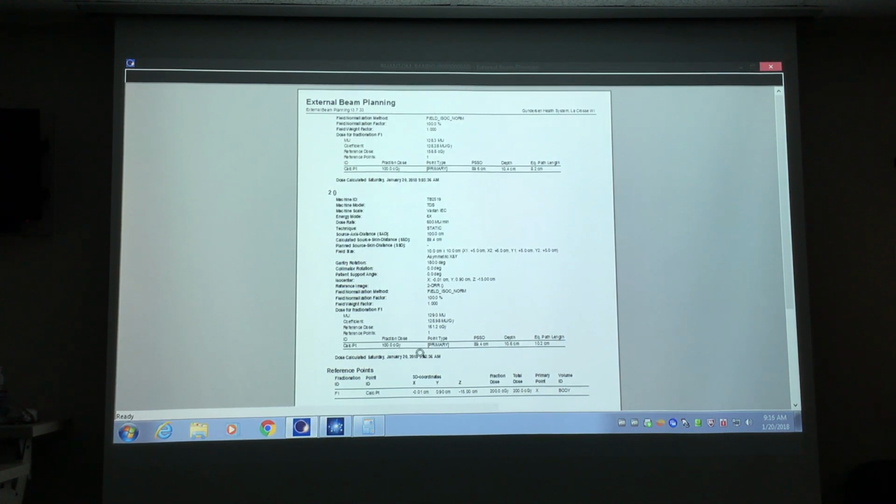So I would encourage you to go through your data book and calculate the monitor units for these. And basically what you're going to end up with is a reference dose, 100 centigray, divided by your collimator scatter factor and phantom scatter factors, which are both 1.0. Then you're left with a TMR and an inverse square factor.